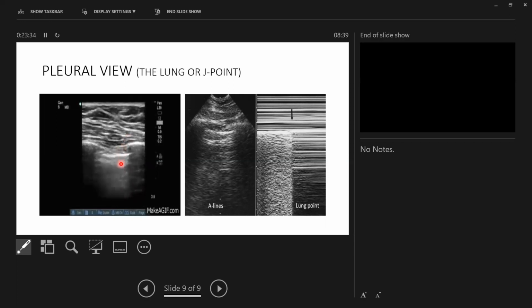You have somebody with a little stab wound who's stable. You see you've just got a little J point at the top. Send them for X-ray, see if you can see how big it is. You don't have to rush to put an IC drain every time you see a pneumothorax. Big sucking wound, and you're practicing, of course, put an IC drain.